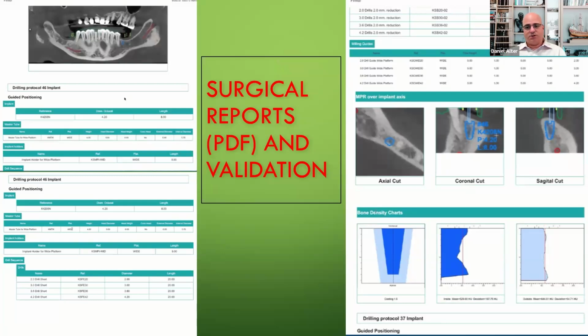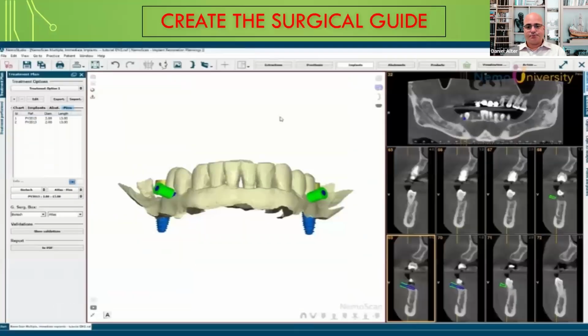Just make sure you don't get yourself into any hot water. It's always the licensed clinician who is responsible for the patient, and they are the ones who have the patient in their care, and they have to sign off on this protocol. Everything else we've done is virtual, but before we commit to the surgical guide, because that means we're committing to the patient, it just needs to be verified and validated and signed by a licensed clinician.